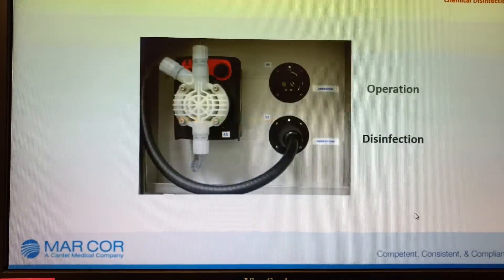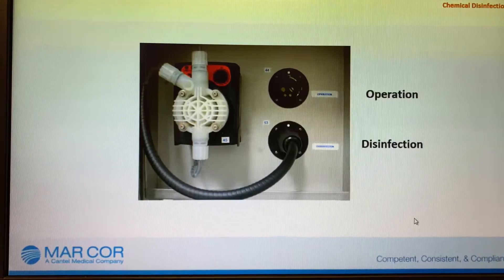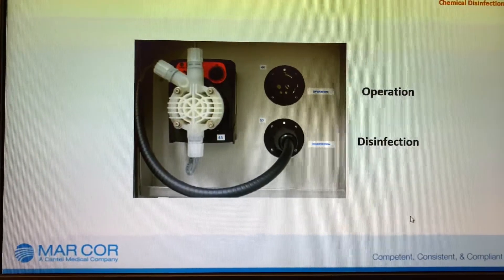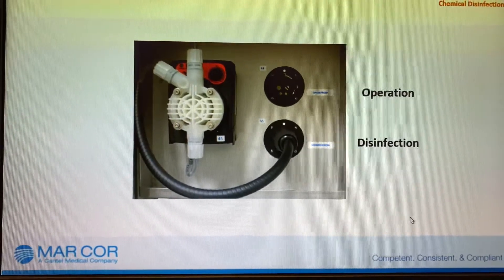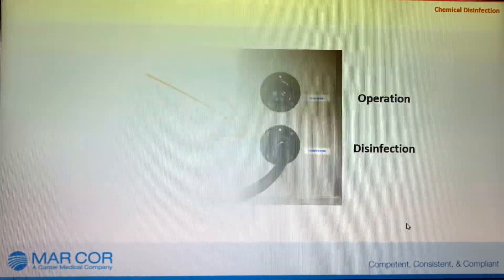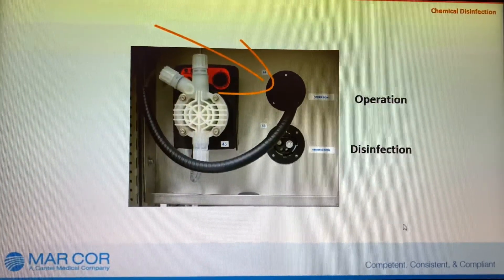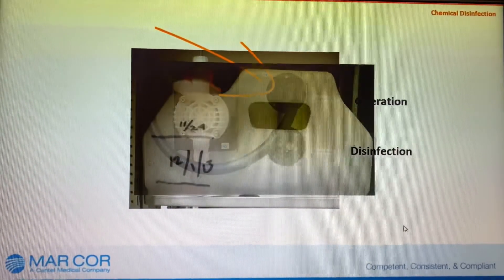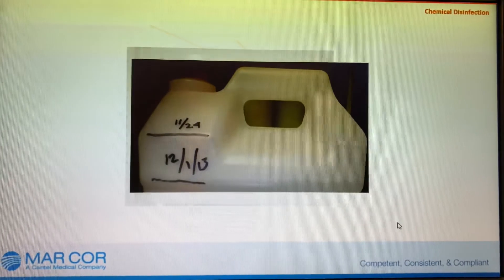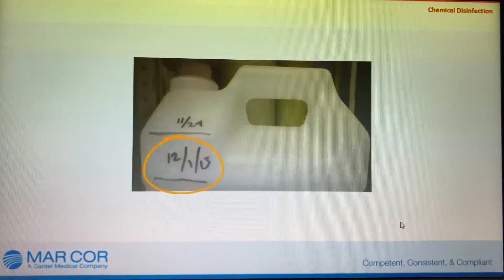When prompted after the 132-minute disinfection program has been completed, open the front door on the CWP and move the dosing connector to operation. Check the chemical level of the chemical disinfectant container, mark the level, and record the date.